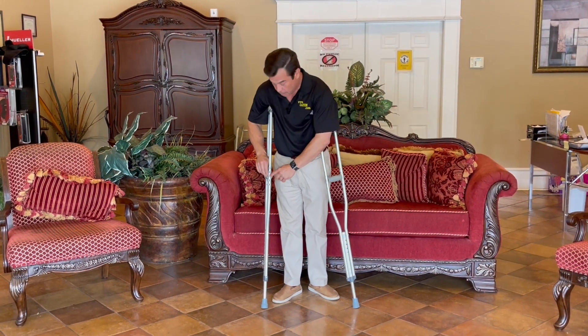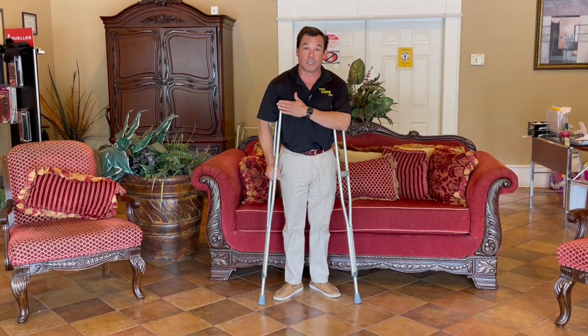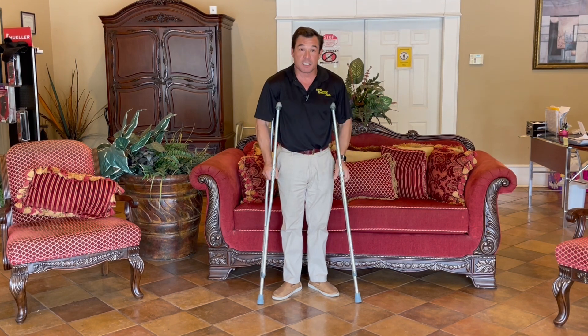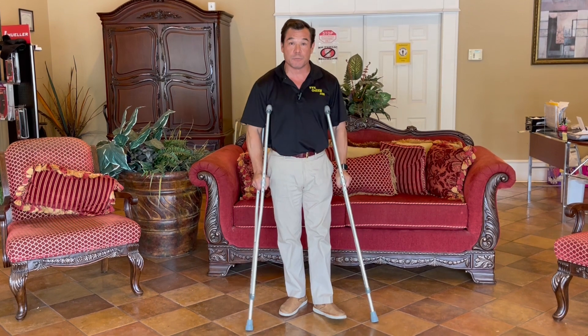When you're adjusting the height of the hand grip, you'll adjust it to where they can comfortably hold the armpit piece below their armpit and the hand piece at a comfortable distance that allows them to put the pressure on their hands to move.